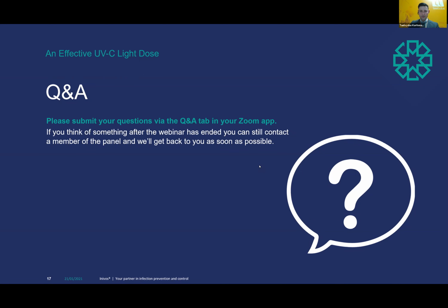I can take the following one, very briefly, on photoreactivation. We did mention it briefly on my slide. It is one of the repair mechanisms, enzymatic DNA repair. So we are aware of it. There is a mechanism for bacteria to almost immediately repair the dimers. It's just one way they're able to do it, so we are considering it.